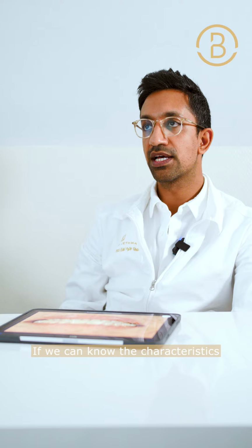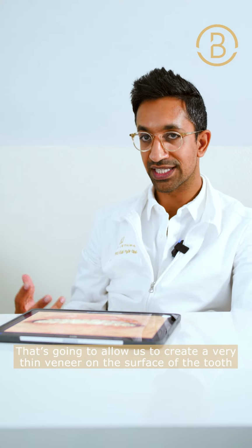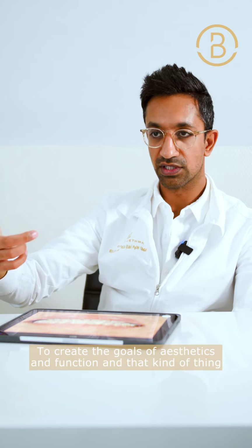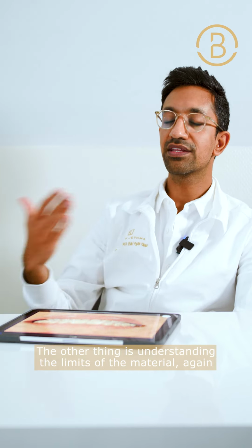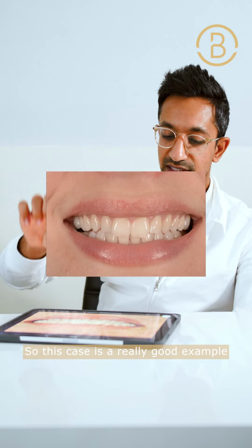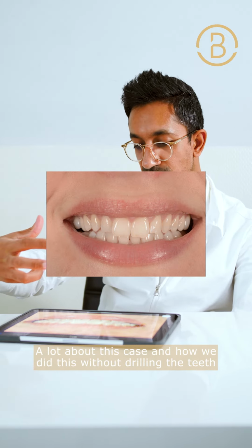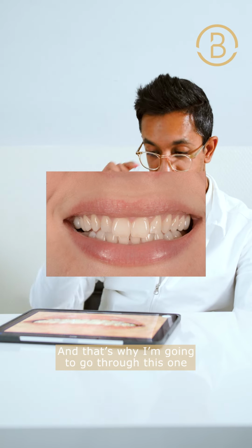If we can know the characteristics that are going to allow us to create a very thin veneer on the surface of the tooth to create the goals of aesthetics and function and that kind of thing, then we know that, okay, this case could be minimal. The other thing is understanding the limits of the material again. So this case is a really good example. On our training courses, we've been asked a lot about this case of how we did this without drilling the teeth. And that's why I'm going to go through this one.